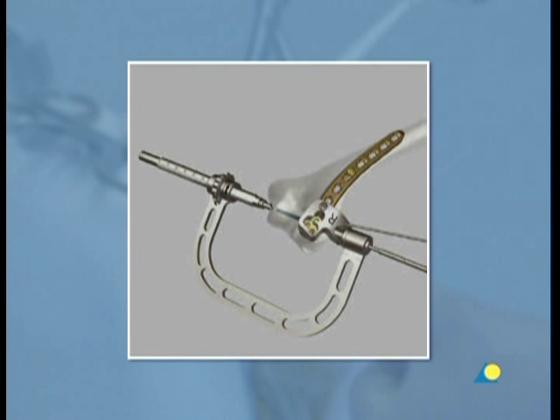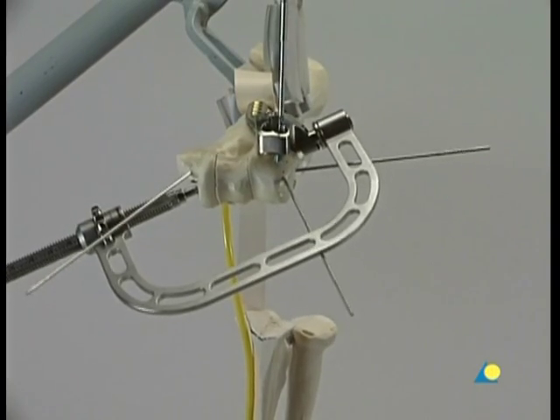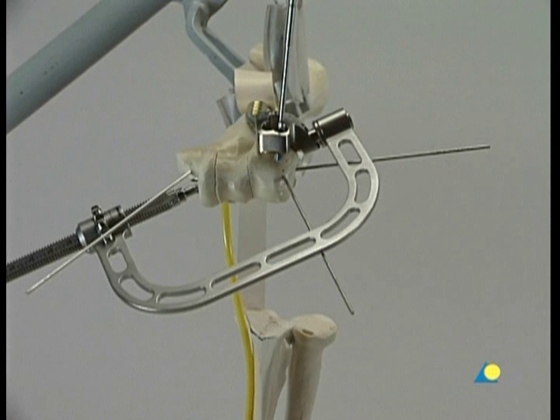At least one screw on the lateral side has to cross the distal block. Depending on the size of the humerus, the screw length is between 40 and 60 millimeters. The LCP drill sleeve and the 2 mm drill bit are used to make additional holes. For the capitellum, the recommended screw length is between 16 and 24 millimeters. However, care must be taken when inserting the screws for the capitellum to make sure that the screws are not too long, to avoid damaging the joint surface.